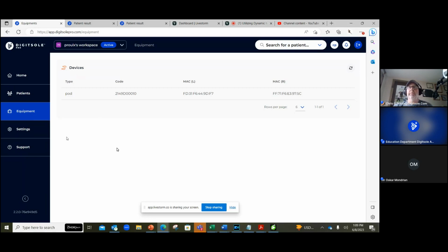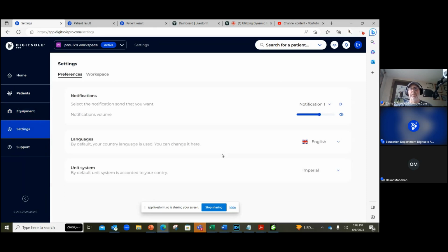That way, you can see what has either gotten better or worse as a result of training, or as an injury, or through growth and development. Also in your settings, you can change this. Obviously, I have mine set to English, and because I'm American I show Imperial, even though we publish our data in the metric system. We consistently use the Imperial system, so I've kind of left it at that because we've got both people here.